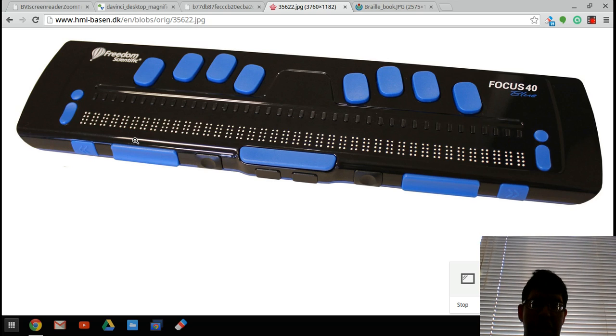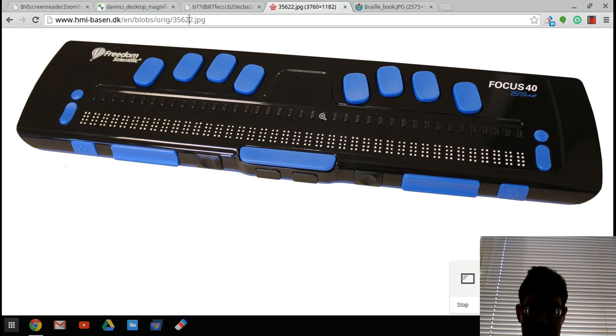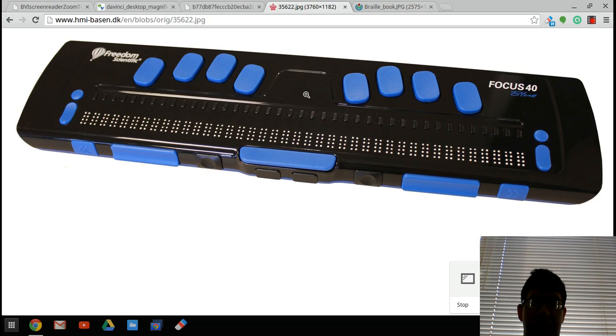Whereas with this, if you had the same URL web address on display here on the 40-character display, I could push a button. And that button would route the cursor, which is denoted by these 2 dots here on the bottom, to that particular character for editing, removal, entry of more characters. It's just much, much more fluid, and it's quieter.